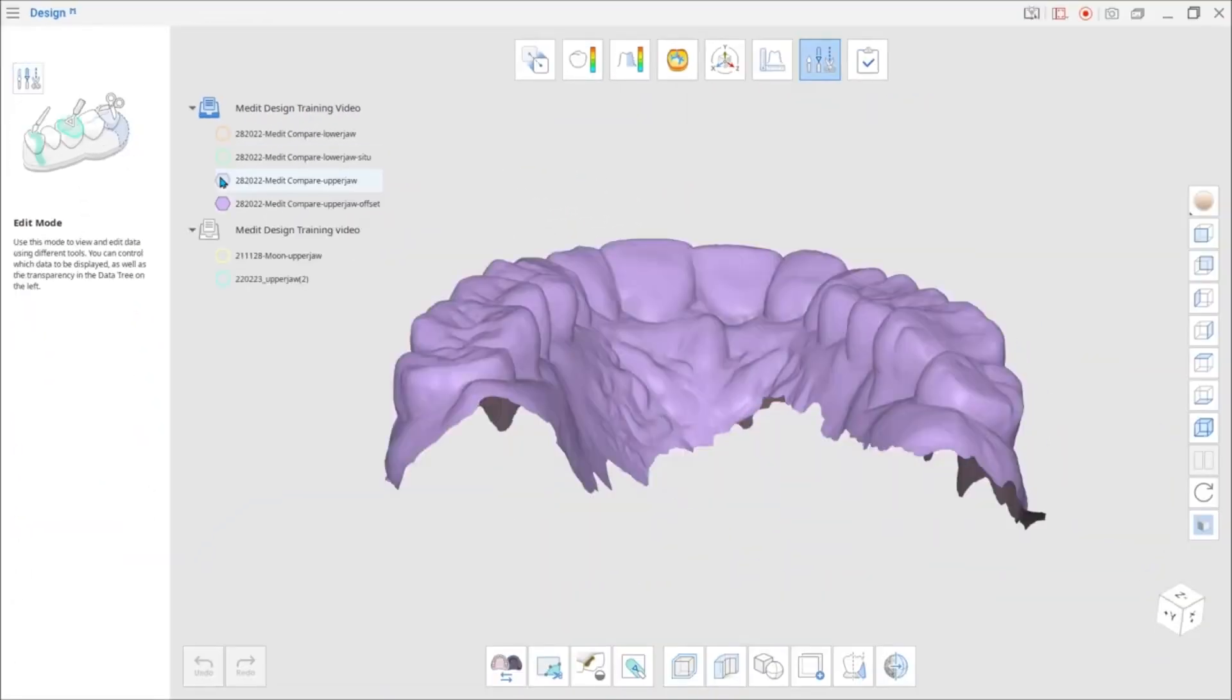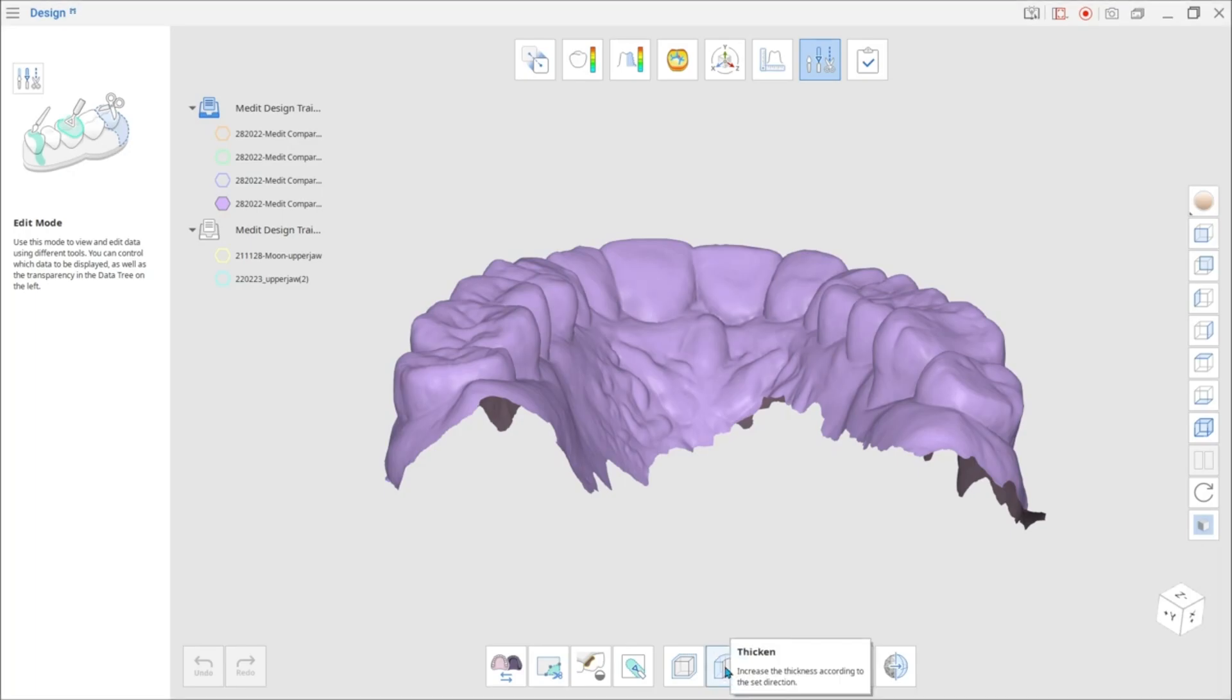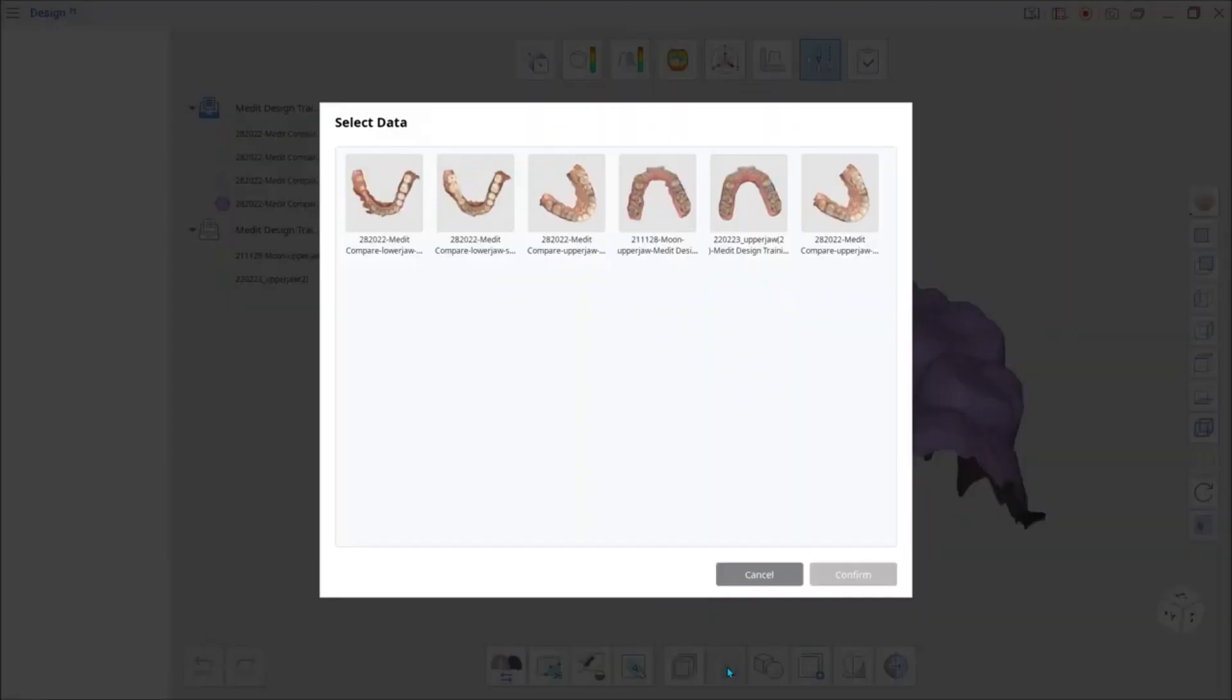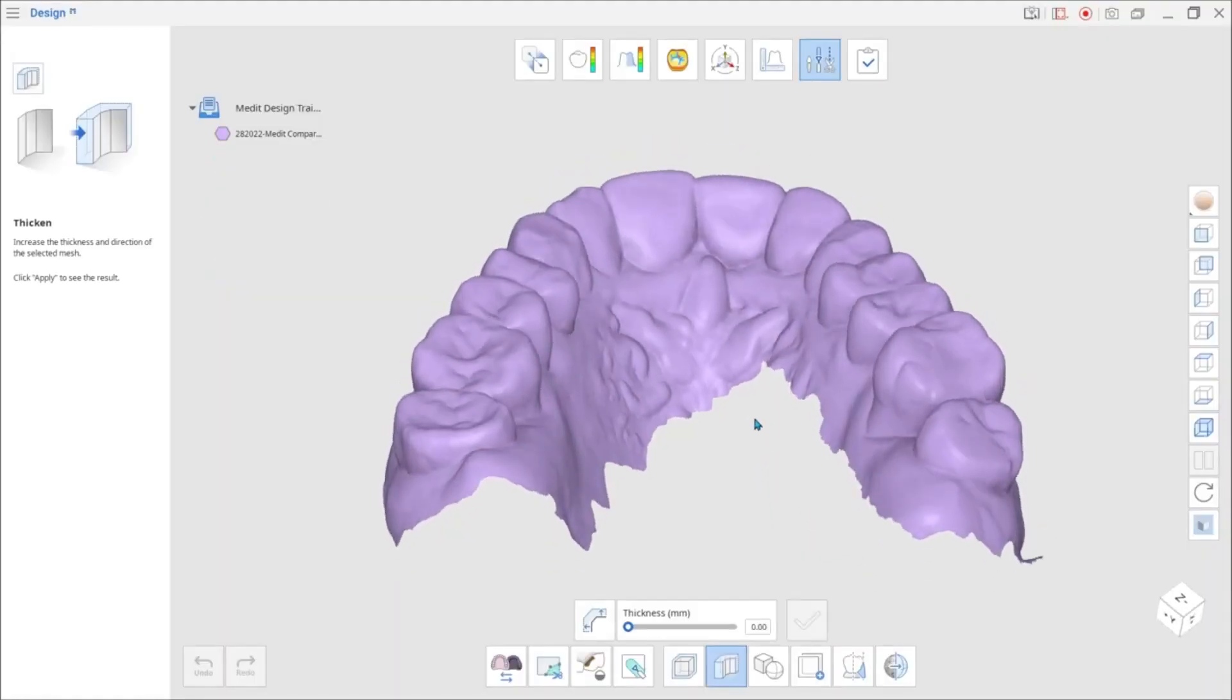Another new feature is Thicken that increases the thickness of the selected mesh. Use this feature to create various appliances like splints, whitening trays, and surgical guides.